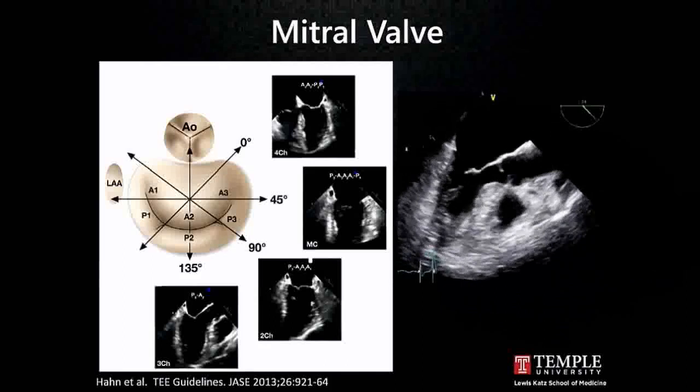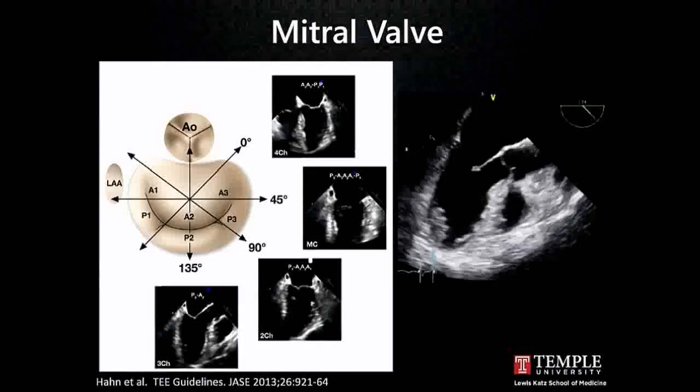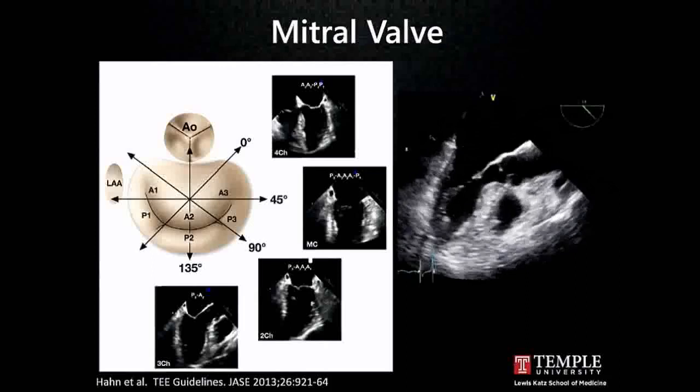I think this you're very familiar with, so I won't go through each of the details, but it shows you an example of some of the figures and images that are available in our guidelines from 2013 now.